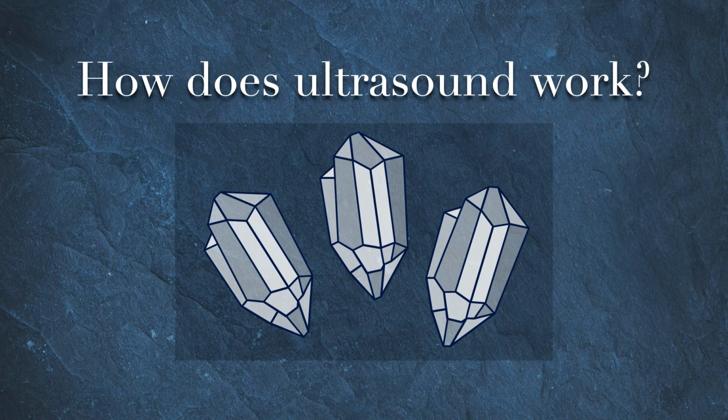In your traditional ultrasound probes, there's something called a piezoelectric crystal, which sits in the face of the transducer. These crystals are receptive to electricity, and once the electrical signal meets the crystal, they deform, generating a sound wave which goes through the transmission medium into your patient's body.